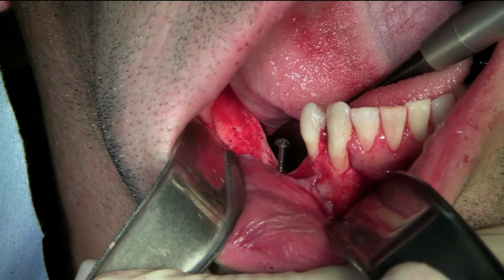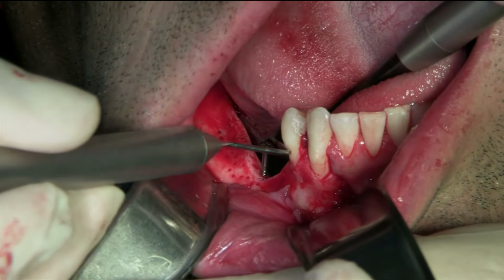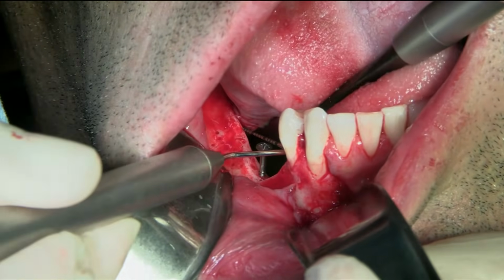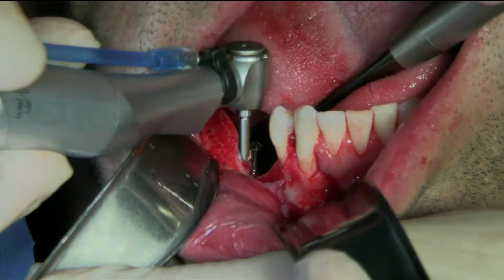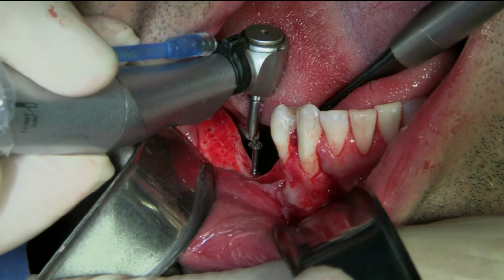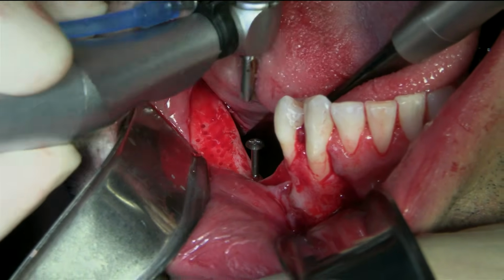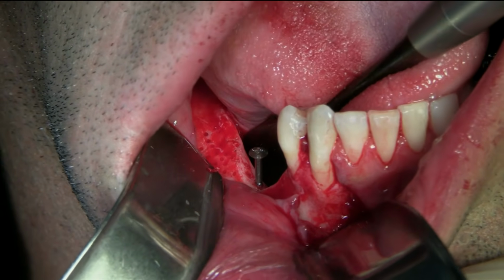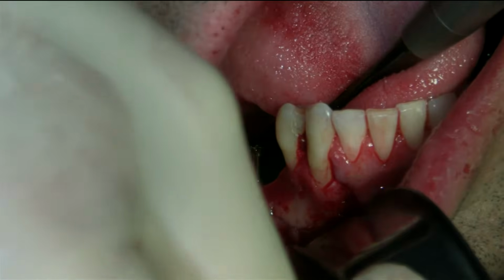So you can see the screw. Okay, hold on. I'm putting it in such a way that it's. Looks pretty good. I can go a little bit deeper. Handpiece again. And place a new 15 and a new 15C. Okay, so we can release the flap. Okay, good. That's the 10 screw. Ready? Okay, so now we're going to release.